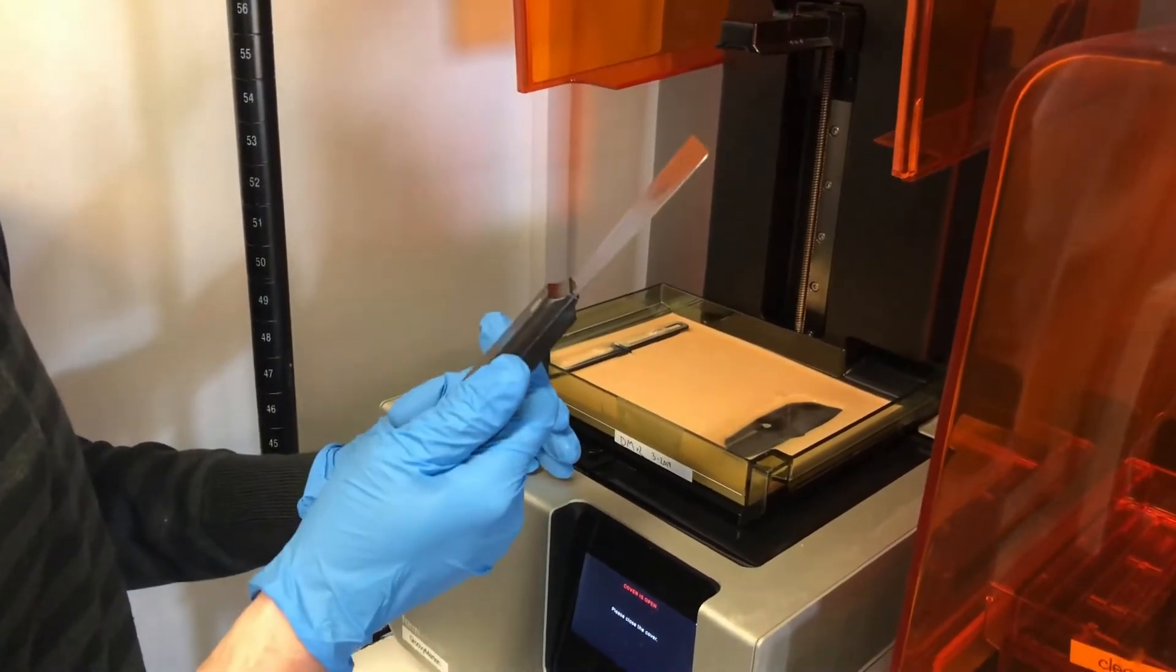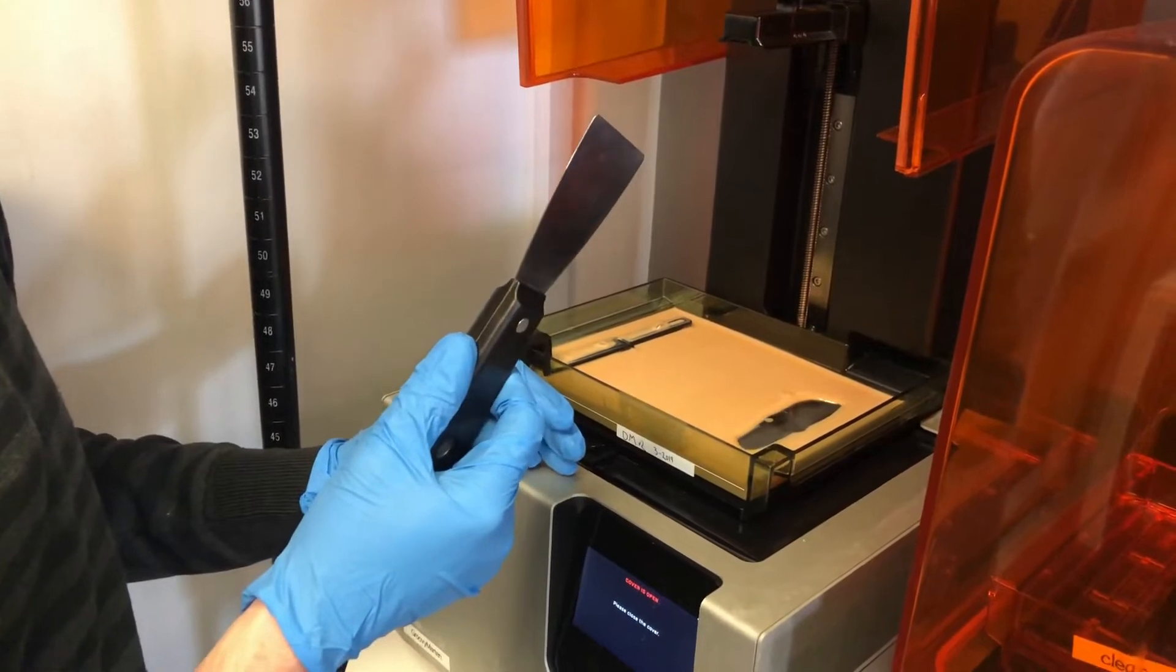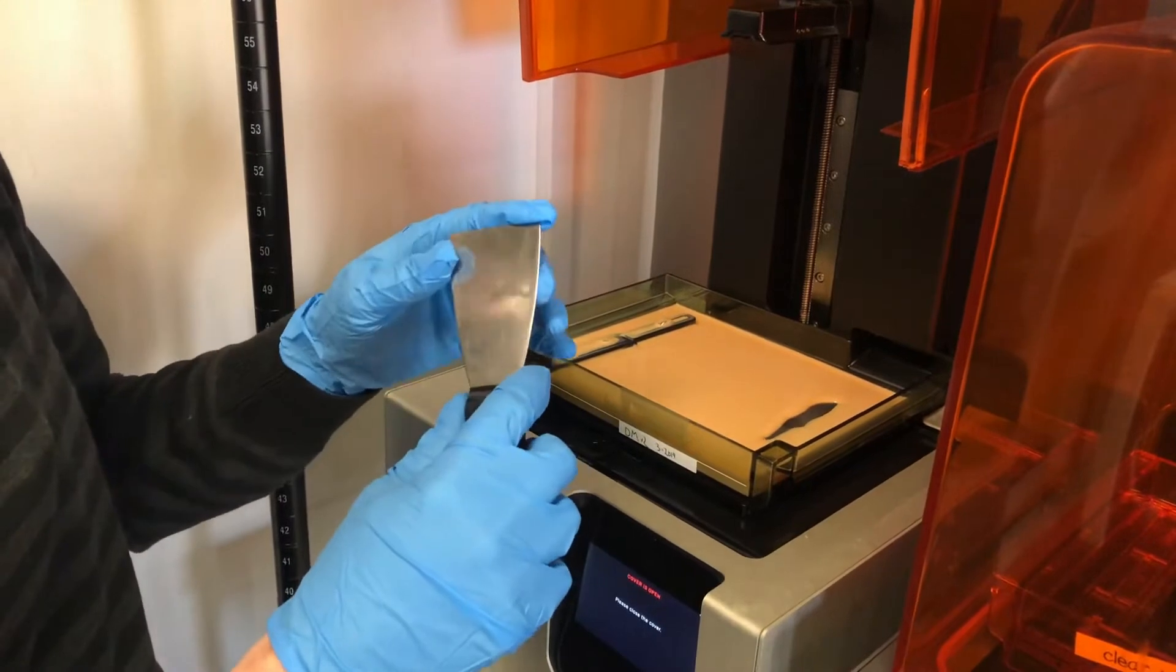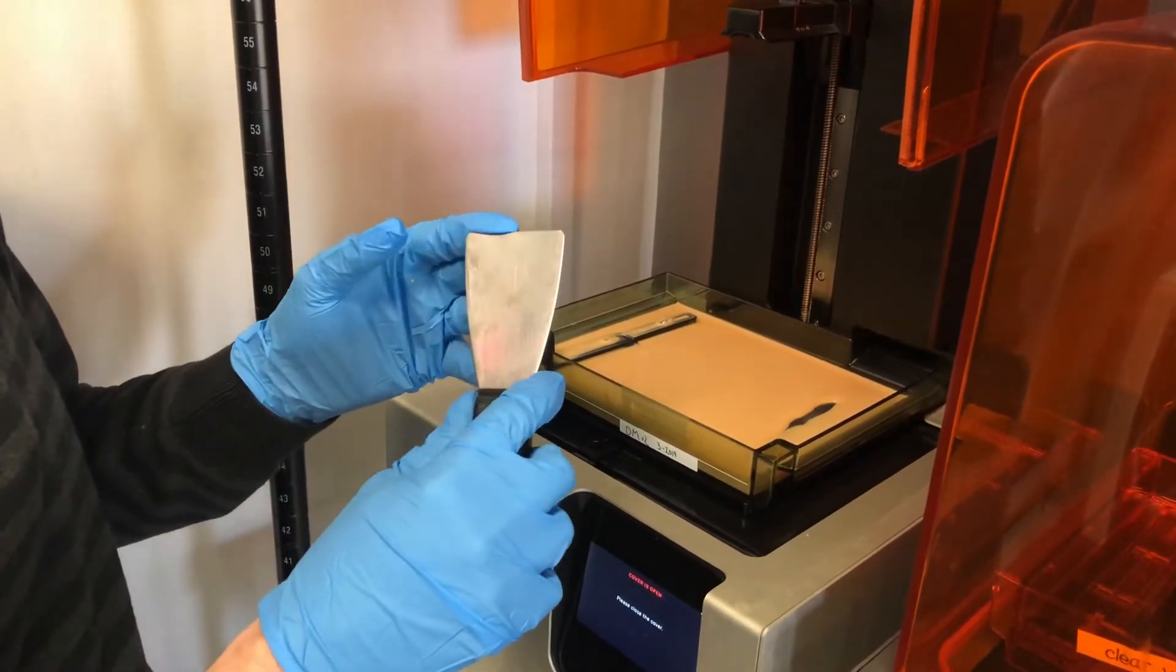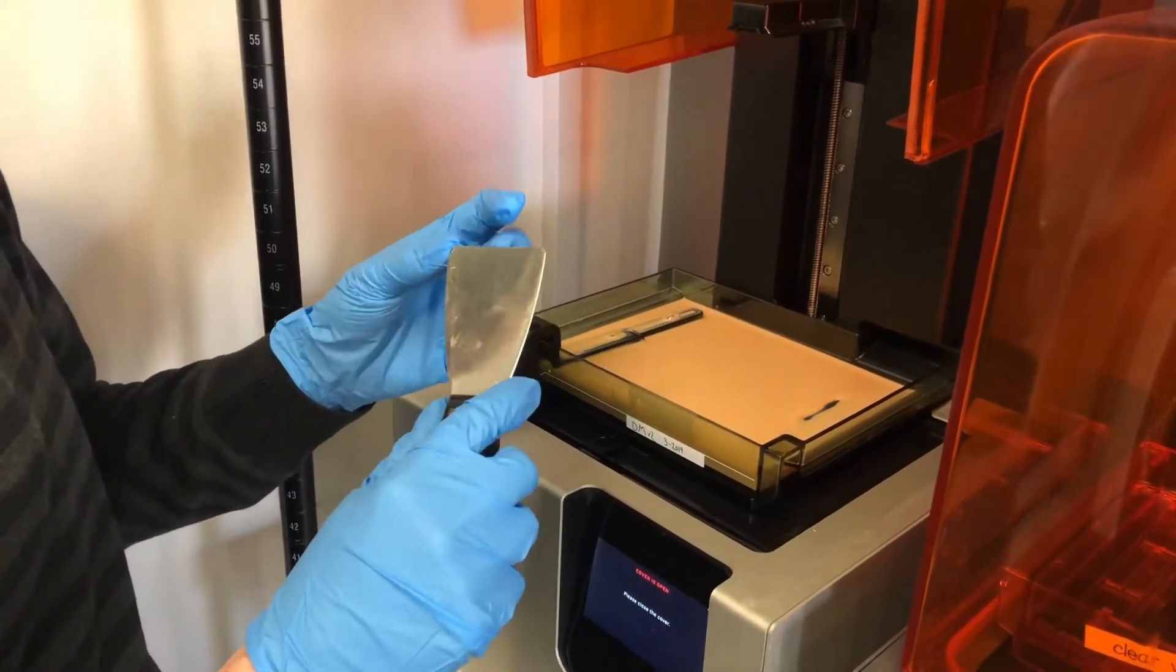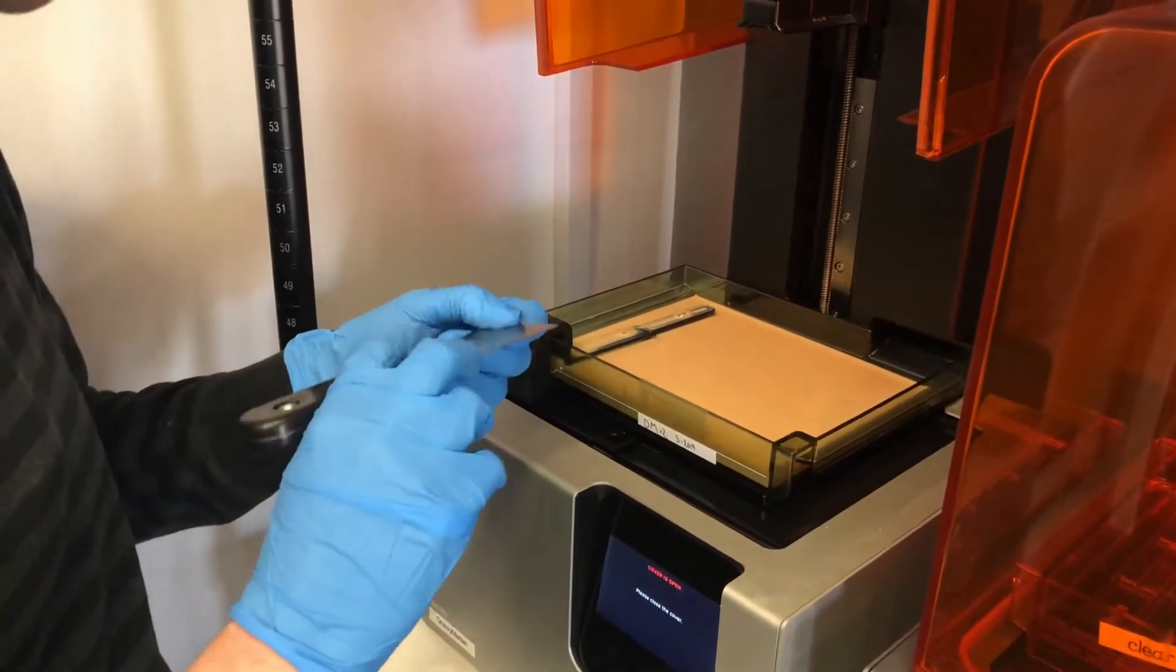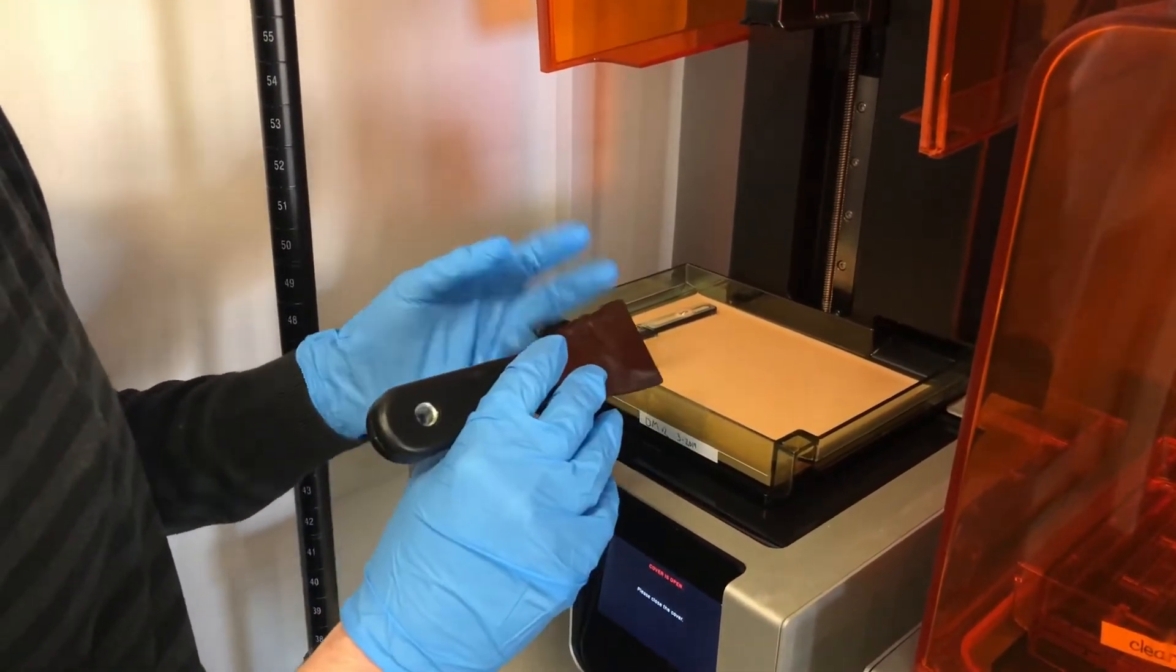Silicone is probably even better, but the important thing is it's never been used to scrape a build plate. It needs to have a perfectly smooth edge. You do not want to use anything with any burrs in it or nicks because you will hurt your resin tank doing this.